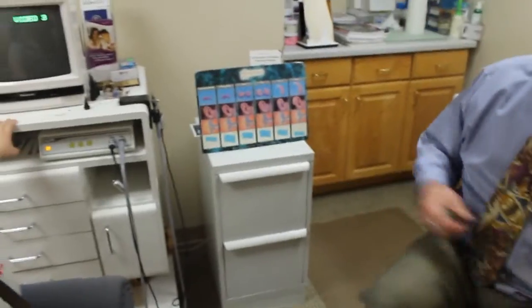Now, one of the things that you're likely to notice is that even experienced users notice their own voice sounds a little bit different with different amplifiers. Yours does too, and mine. Oh my gosh, my voice does sound different. Hi, Ann. How's it going? This is my voice. Do I sound normal? Do I sound weird? No.